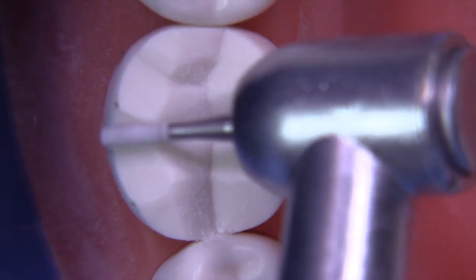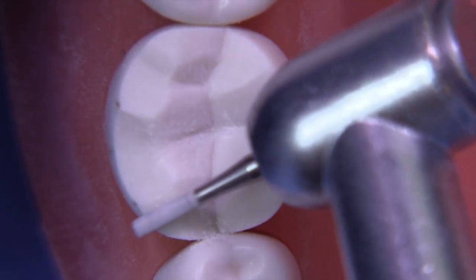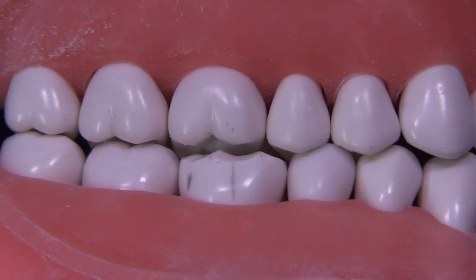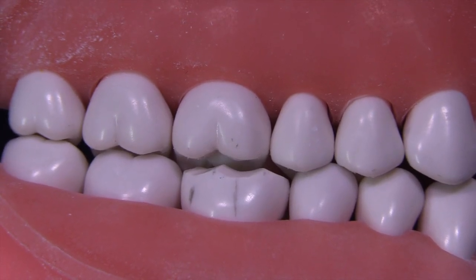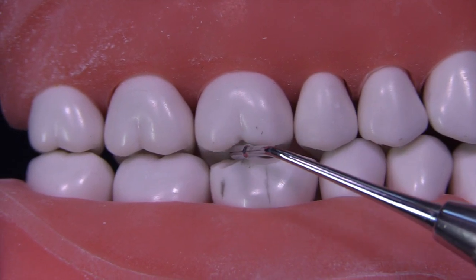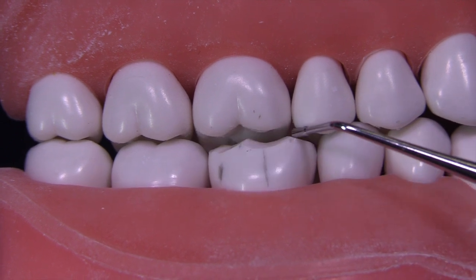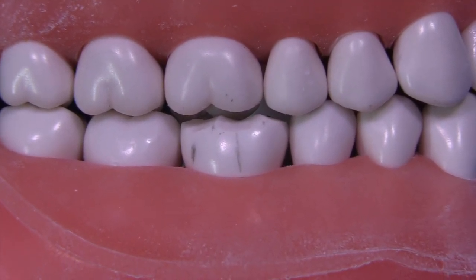A student asked me the other day how many preps you have to do to get really good, and I said I don't know — five thousand? It's a lot of preps. Don't expect to reach the level of mastery on anything until you've done probably about ten thousand hours of work. Now we can see about 1.5mm of clearance on the distal portion; the mesial portion is still a little bit under-reduced, somewhere in the 1.2 to 1.4mm range. The RGS3 fits easily, so we know we're well beyond one millimeter of clearance, but not quite enough — let's keep going with the reduction, then move on to the axial.